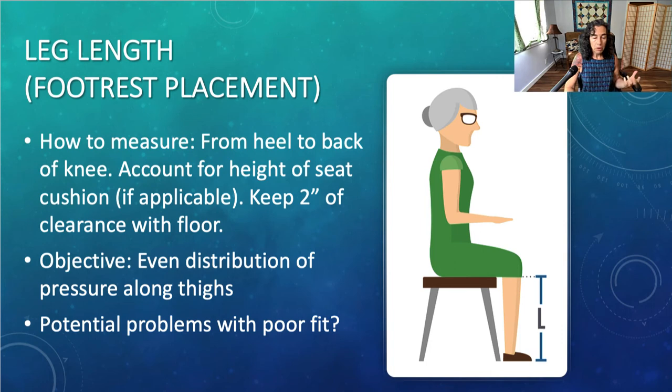So if the footrests are too low, the pressure is down under the thighs, right? And the footrest can drag. It also can contribute to foot drop, which is a condition where the foot goes into a little bit of pointing, or dorsiflexion. No, plantar. Oh, I'm on camera. Foot point. You tell me, dorsi or plantar flexion. I'm getting my terms confused this morning.